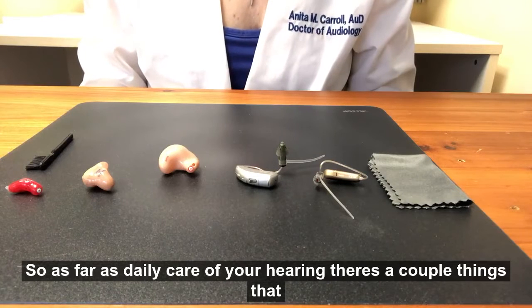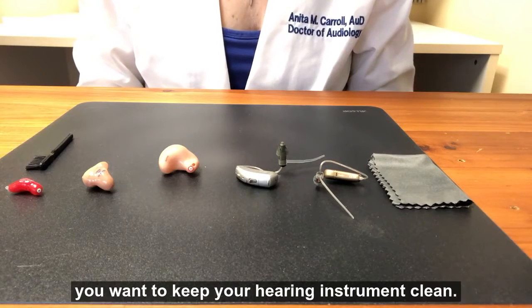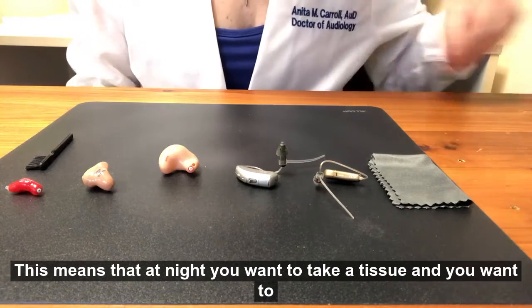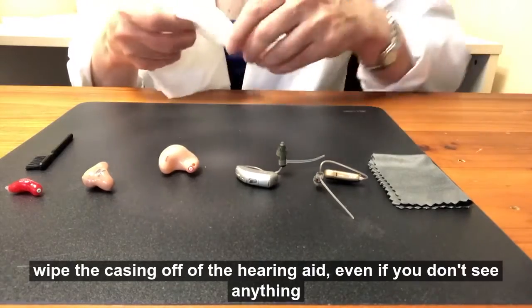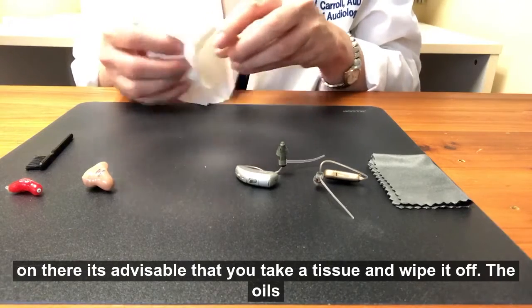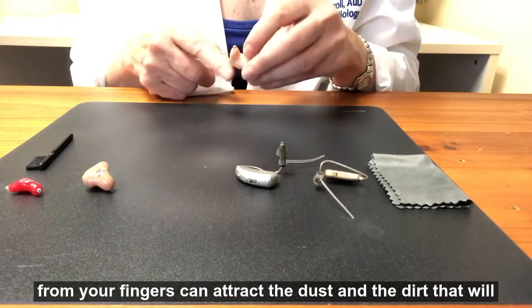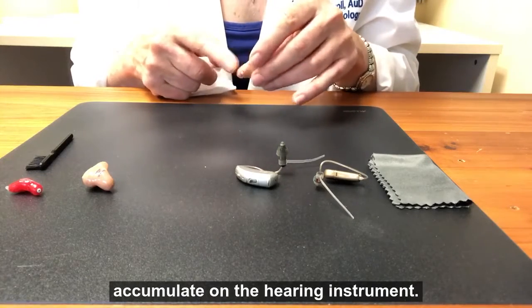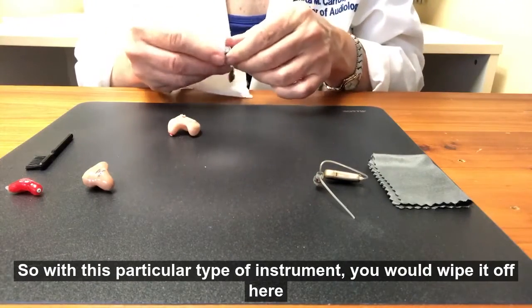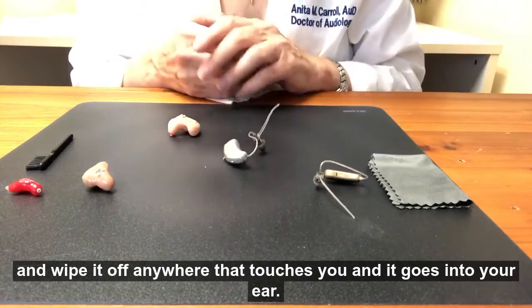As far as daily care of your hearing aids, there are a couple things you want to do. First and foremost, you want to keep your hearing instrument clean. This means that at night, you want to take a tissue and wipe the casing off of the hearing aid. Even if you don't see anything on there, it's advisable to wipe it off. The oils from your fingers can attract dust and dirt that will accumulate on the hearing instrument. You would wipe it off here and anywhere that touches you and goes into your ear.